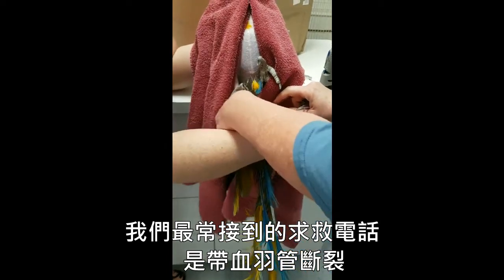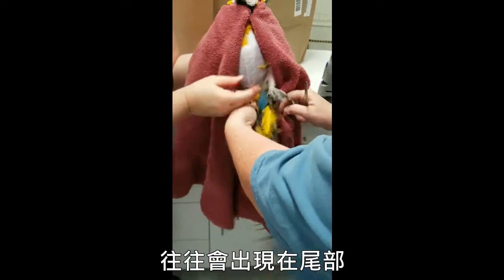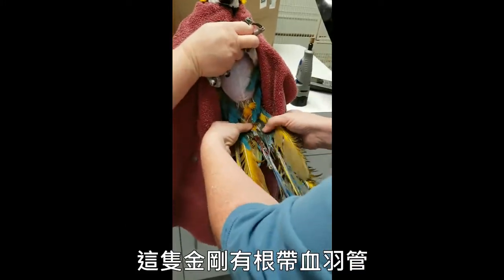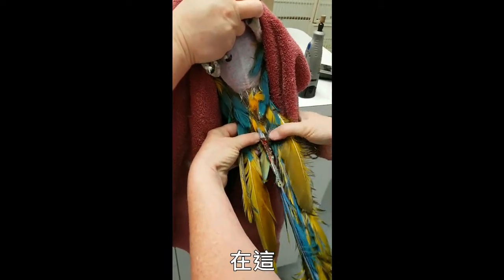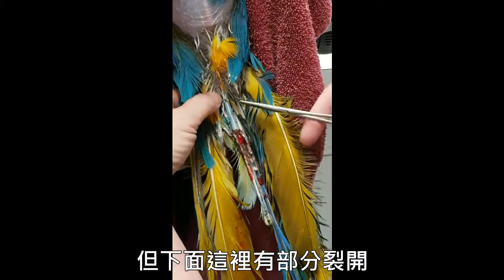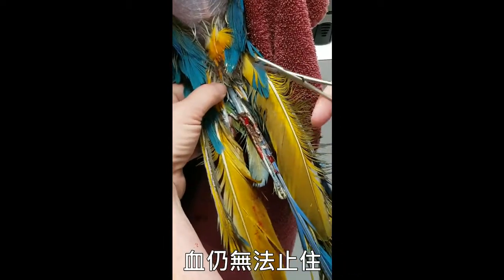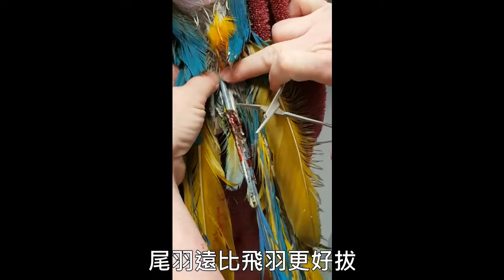The most common emergency call we get is a broken blood feather, usually on the wing, occasionally on the tail. This macaw has a broken blood feather right here. Most of the shaft is intact, but part of it got cracked down here. It's already had some quick stop applied, and that's not going to control it, so we're going to have to pull it. Tail feathers are a lot easier to pull than wing feathers.